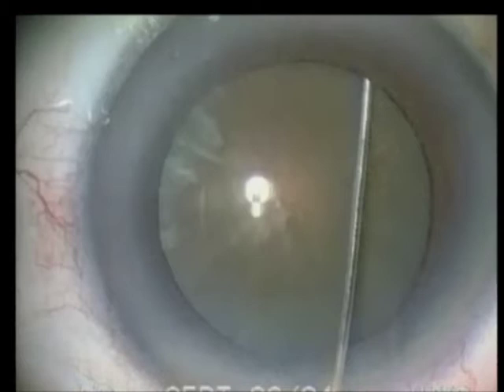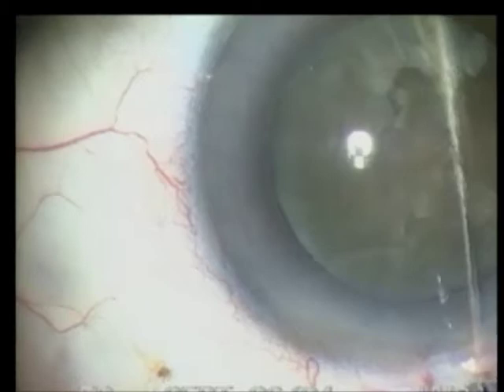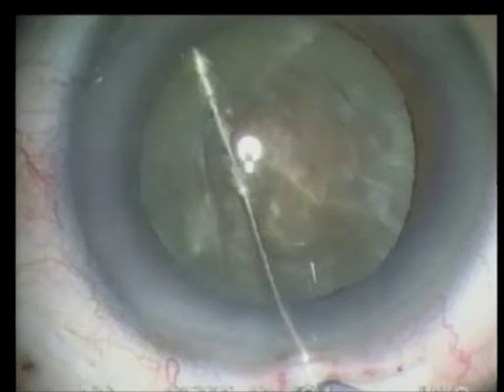For hydrodissection, a straight cannula is placed inferiorly between the anterior capsule and the lens. While lifting slightly, a fluid wave is directed between the outer cortex and the capsular bag. Additional cortical cleaving is performed at 4 o'clock to ensure complete hydrodissection. To ensure that the lens has been separated from its capsular attachments, I rotate the lens within the capsular bag. Hydrodelineation is not possible in a lens of this density.